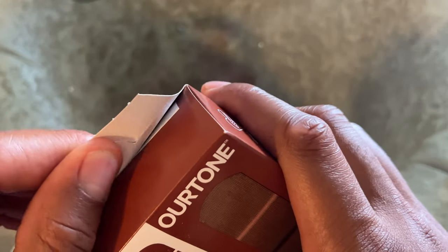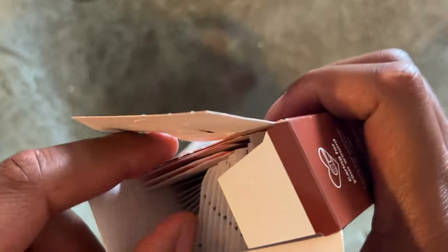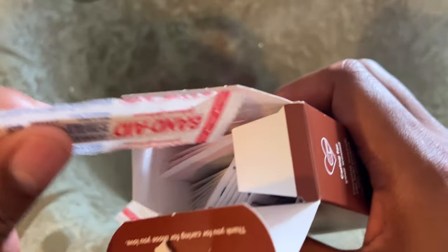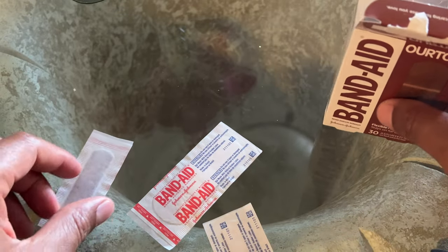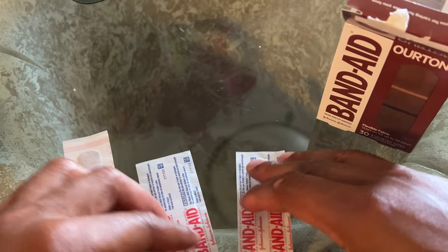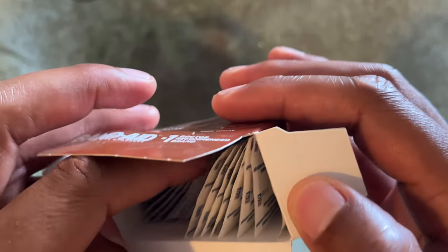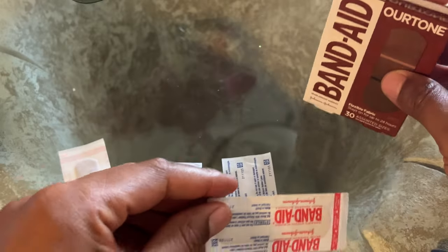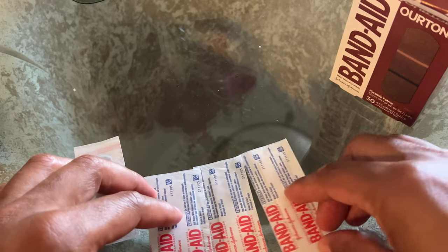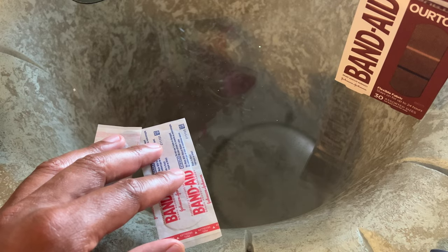I'm going to go ahead and open these up. Look at this — here's one of the bandages. I'm just going to pull out some of them so you can see the different sizes. You have the 5, 10, and 15. I'm just going to use two of the sizes — I'm assuming there are three different sizes, but I'm not sure.